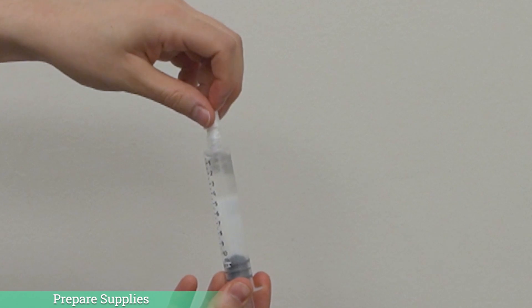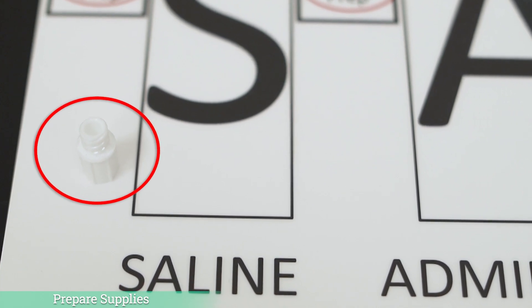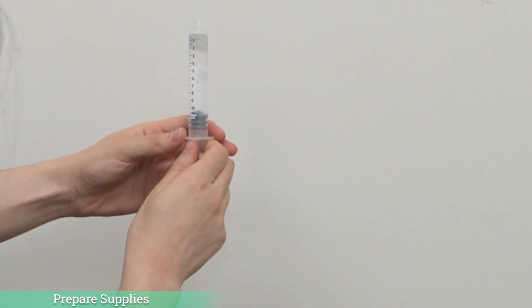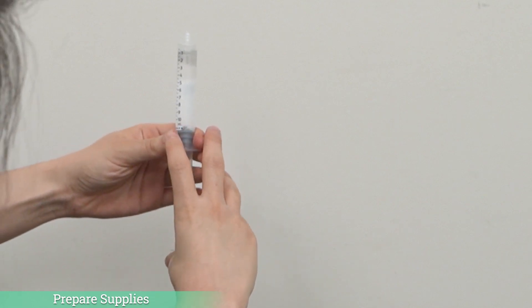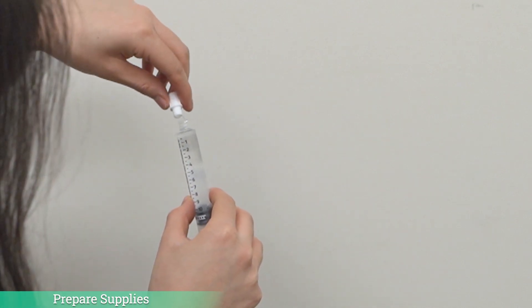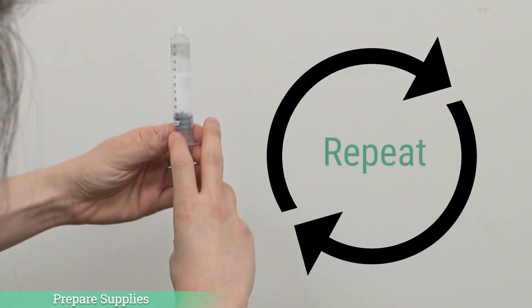We are now ready to prepare our supplies. Start with the first saline syringe. Remove the protective cap on the syringe and place the cap flat side down on the table. You will need to replace the cap on the syringe later, so you want to make sure that the inside of the cap doesn't touch anything or get dirty. Hold the syringe with the end up and the plunger at the bottom. Pull back on the syringe plunger slightly to break the seal on the syringe. You will be able to see the tiny air bubble in the syringe. Slowly push the plunger up to let that tiny air bubble out. Once the air is removed, pick up the cap from the table and replace the cap on the end of the syringe. Place the syringe on the sash mat on the first S. Repeat this step for the other syringes on your board.